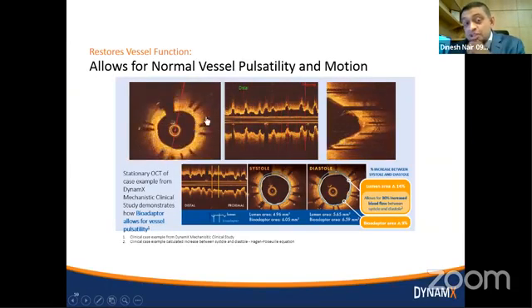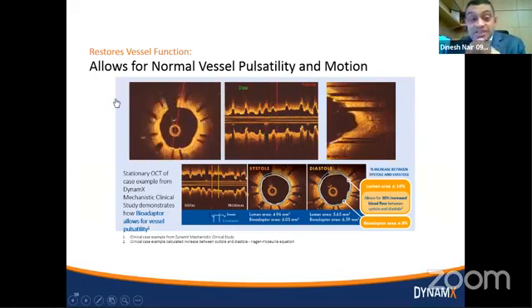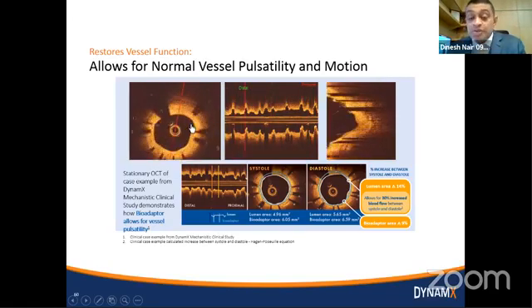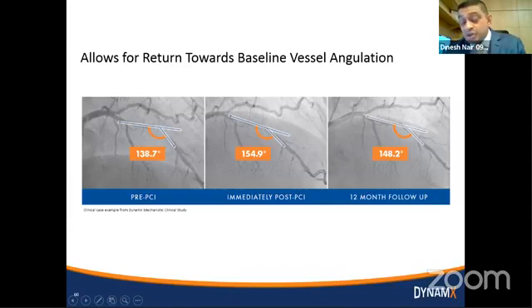This is another technology that we tend to use in our procedures, which is optical coherence tomography, OCT, using light rays. And these are actually the stent struts with an acoustic shadow behind them. And after the uncoupling, this allows this to move this way. Absolutely beautiful. So I'm looking forward to using these stents. What we've been showing you up till now have been stuff that we've been using. This is something that's coming and we're planning on using.